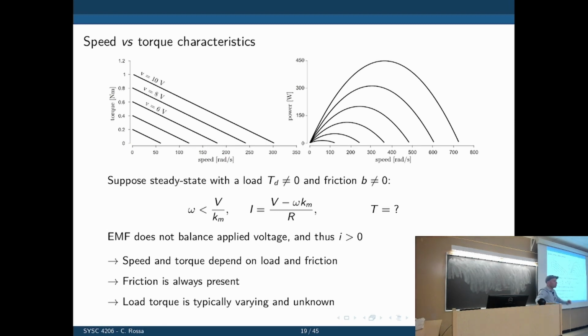Assuming no load, we turn the motor on, the speed goes up and reaches a plateau. The back EMF will overcome the force of going forward, like it'll start slowing it down by a certain threshold. Well, it's not necessarily the back EMF, but it's friction that now creates a counteracting torque that increases with the speed.